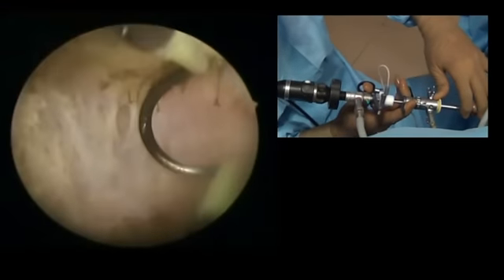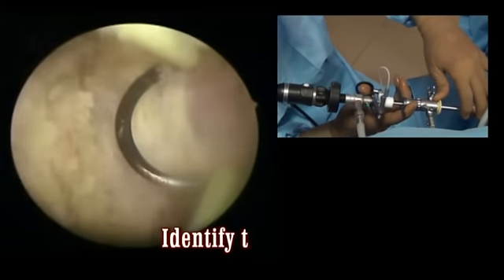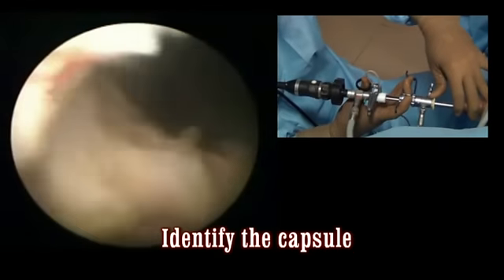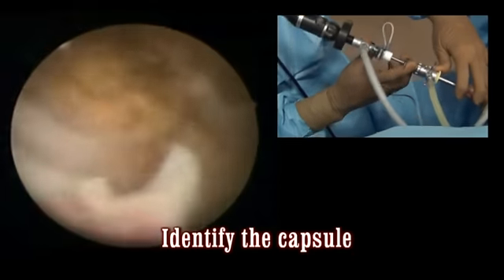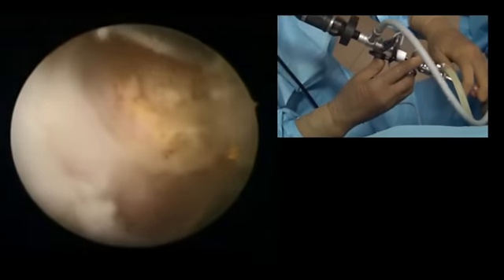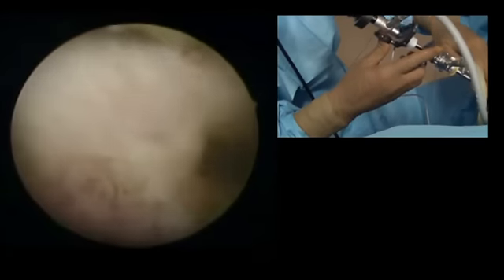This is the capsule again, which I opened — it is a little deep cut, but again it is not bleeding, so not a problem at all. I am fortunate that way. I cut a little bit here — you have to cut to the capsule.